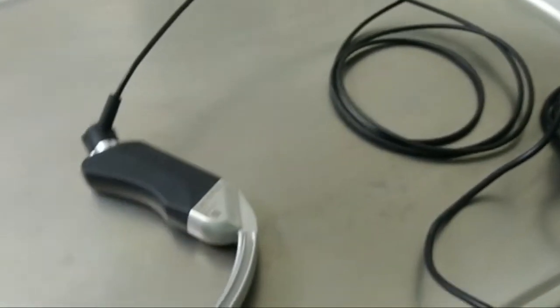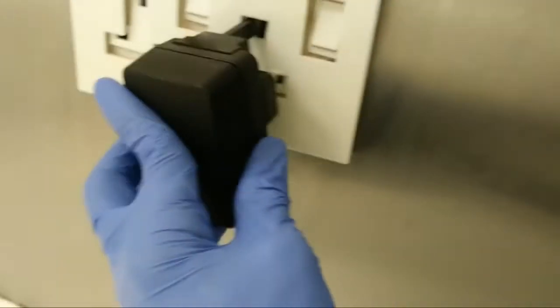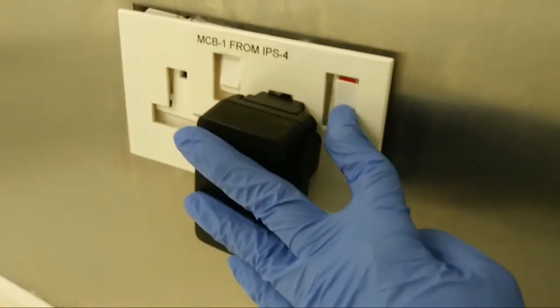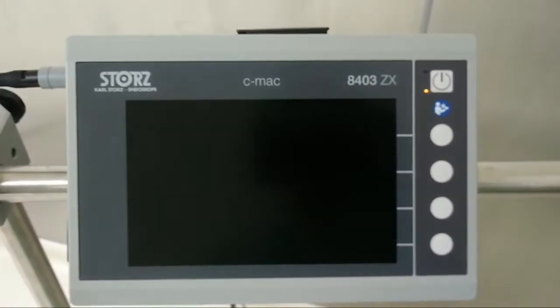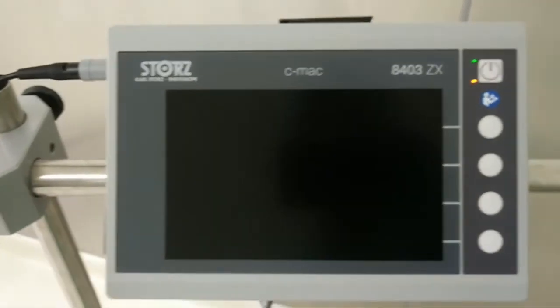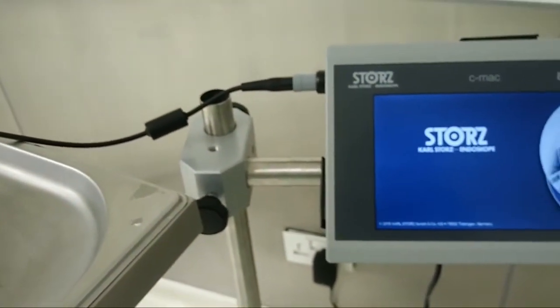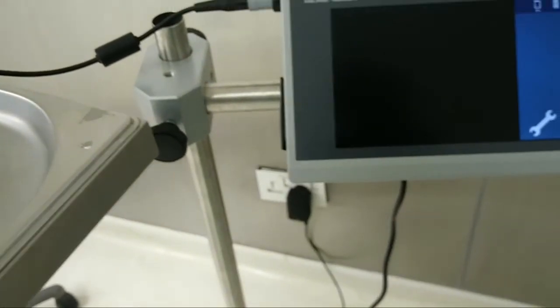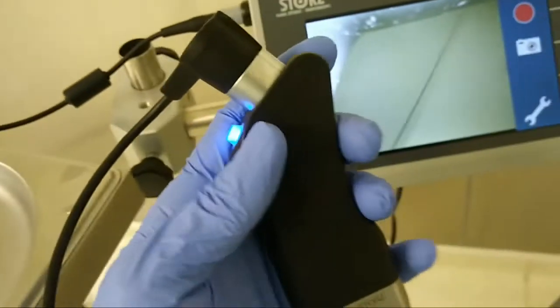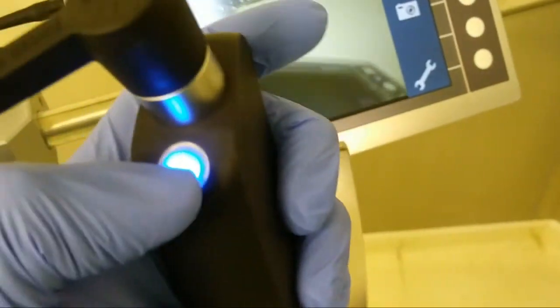We should prepare and check all items before each procedure. We should also keep another ordinary laryngoscope and the difficult airway cart ready for use, because this is electric equipment and anything can happen. It is just a precaution. I have not had any incident like that. I just told you, precaution is better than the incident.